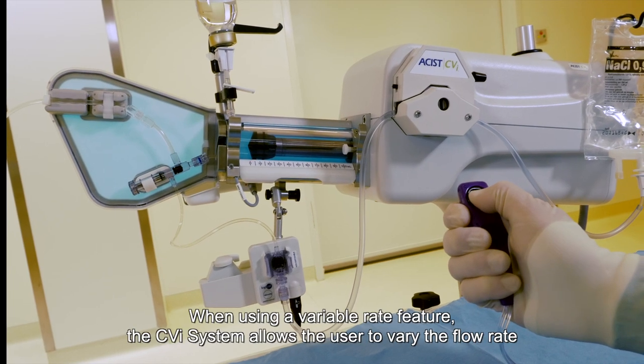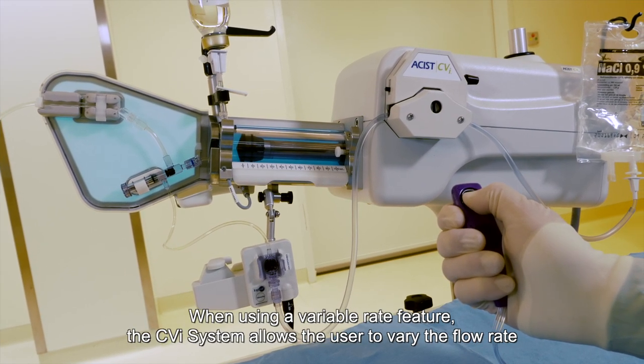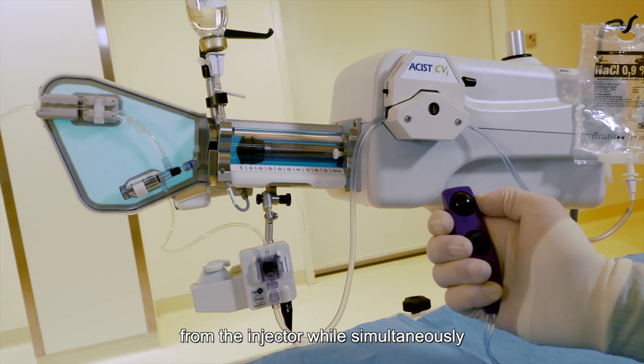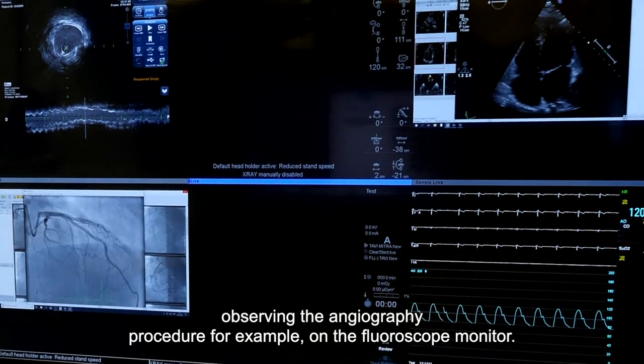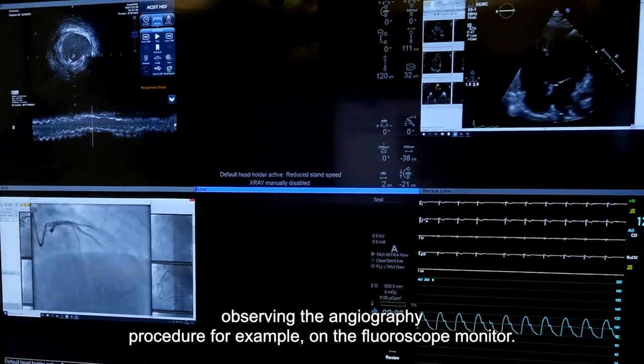When using the variable rate feature, the CVI system allows the user to vary the flow rates from the injector while simultaneously observing the angiographic procedure, for example on a fluoroscope monitor.